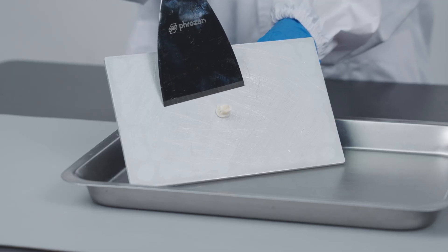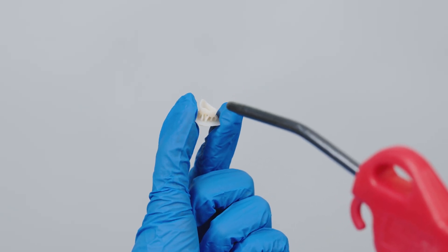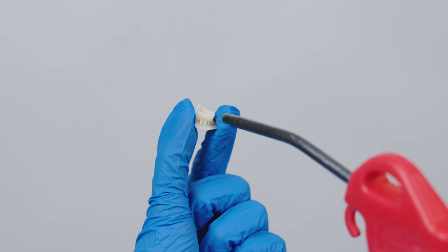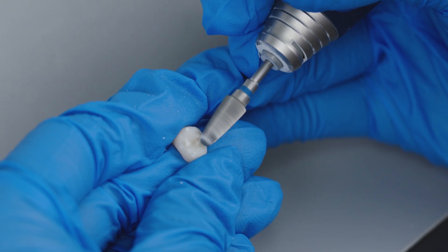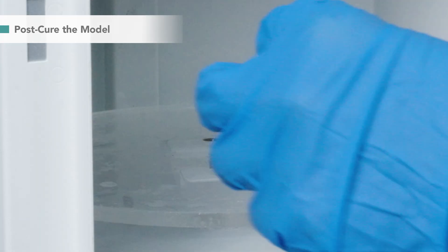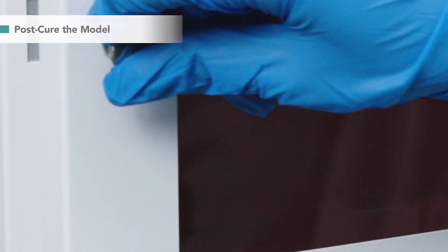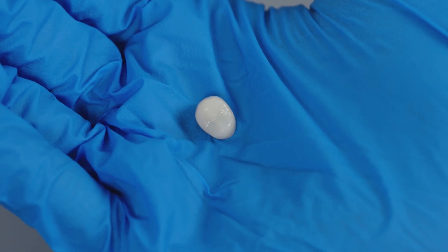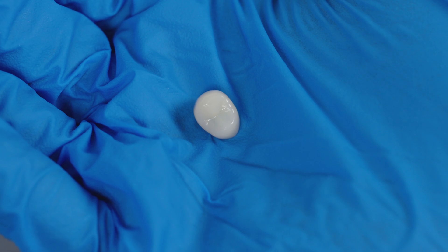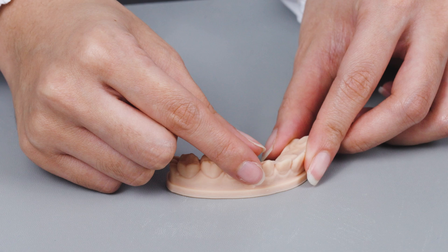After cleaning, remove the crown from the building plate. Use a compressed air gun or simply keep it in the dark for 30 minutes to dry the model. Remove the support, then post-cure the crown with a compatible UV cure station to maintain its strength and biocompatibility. Here we finish a crown in around one hour.